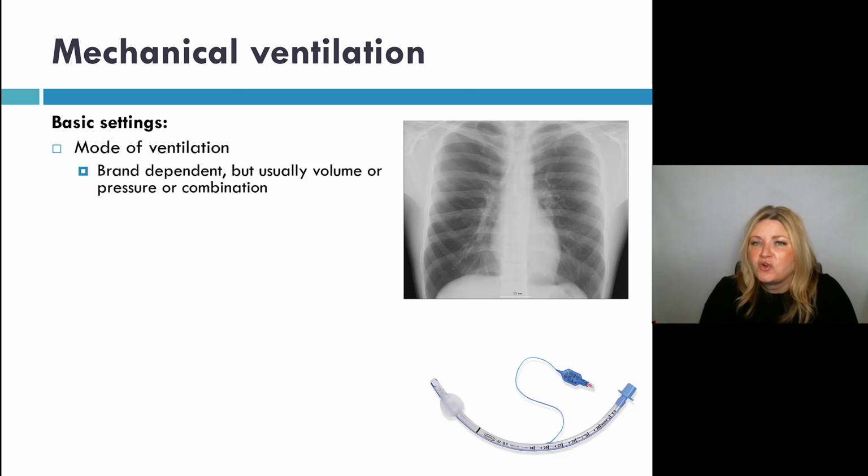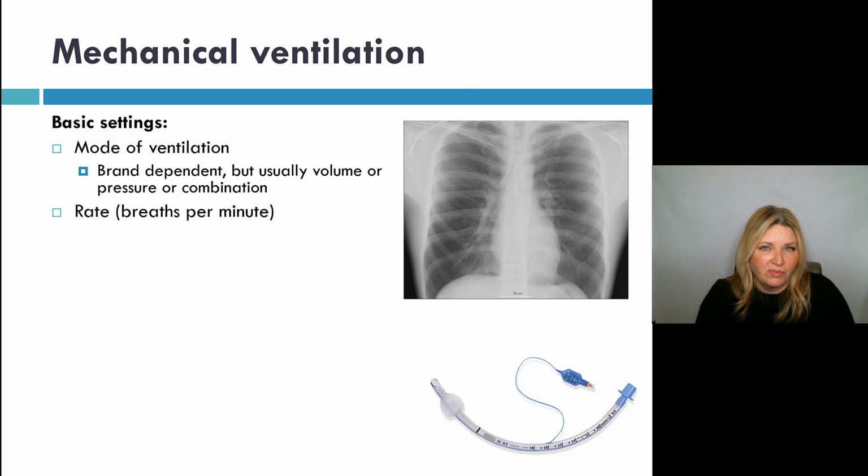I have to say, respiratory therapists are invaluable when it comes to mechanical ventilation and really guiding therapy. But the bottom line is the best mode of ventilation is the one that you know how to use in your facility and you're comfortable with, especially in a patient who you're trying to rescue. I will say most modes of ventilation are volume modes of ventilation. I'll get back to that in a second.